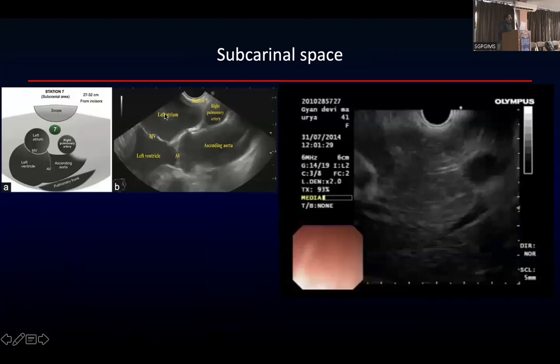What you were doing initially, I told you, you see the IVC, reach the right atrium. From the right atrium, you pull the scope further, upward, pull the scope. Then after the right atrium you will see the left atrium. Slide up on the up down knob.